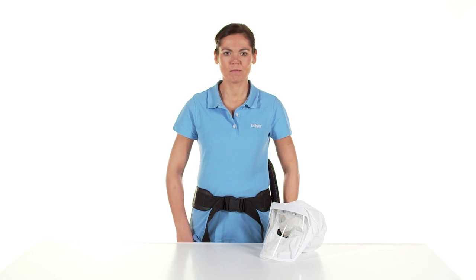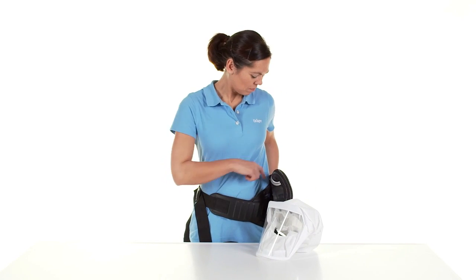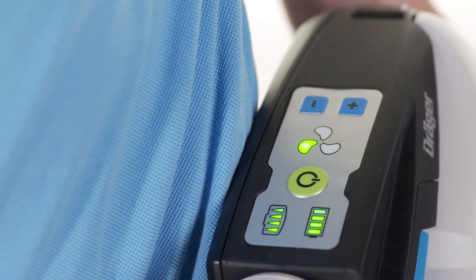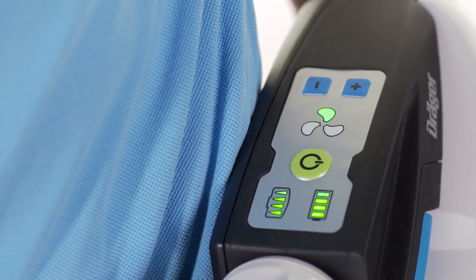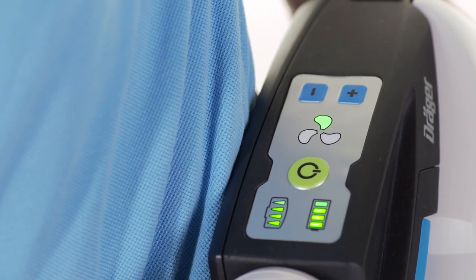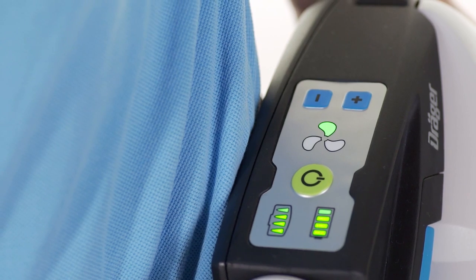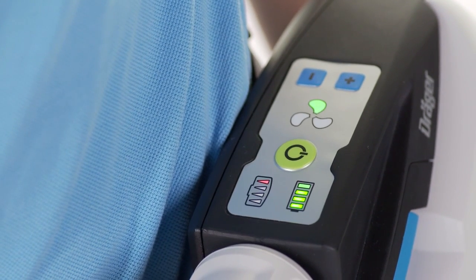To switch on the unit, turn it towards the front if necessary and press the green button on the control panel. After switching on, the device performs a self-test. The indicator lights on the control panel light up green if the device operates properly. If the device does not operate properly or warnings are triggered, there is a fault. This fault must be eliminated before using the device. For further information, please see the instructions for use.